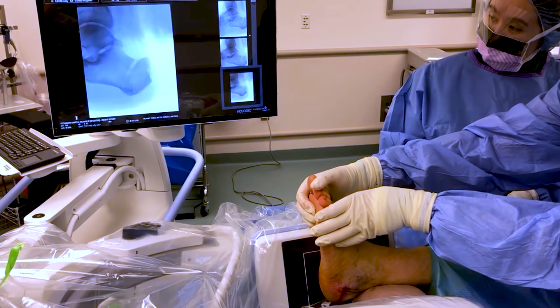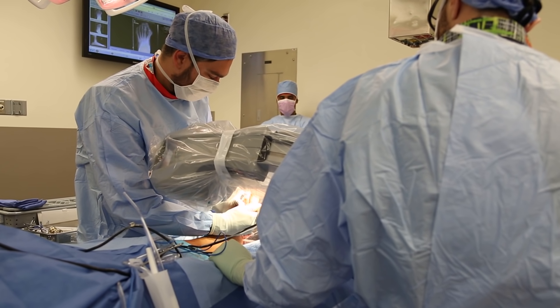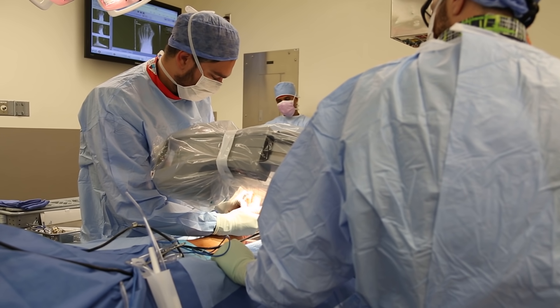It's a minimally invasive technique, which was really developed decades ago in Europe, but it was done with a much more invasive approach. With the availability of minimally invasive instrumentation, what we do is a 3mm incision. We remove a little wedge of bone from the heel bone, so we're not even touching the Achilles tendon.